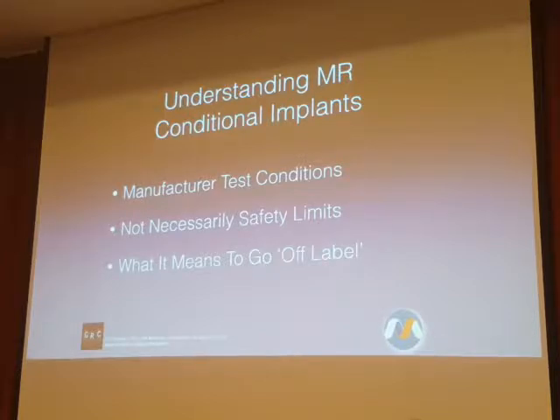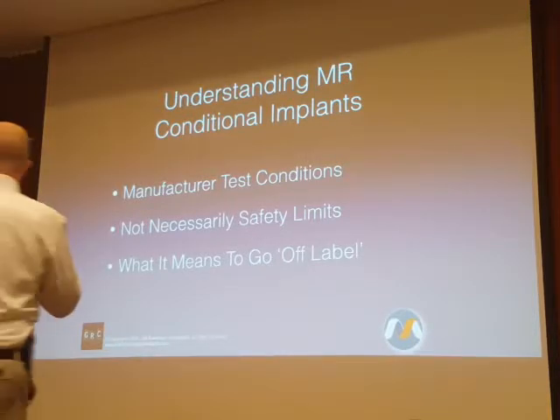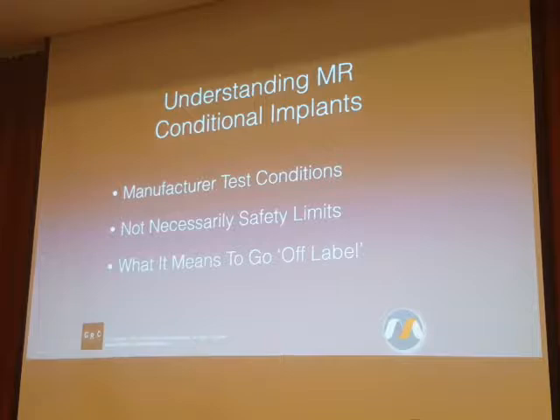I'll give you an example of this. I was working with an implant and device manufacturer. Years ago, they had tested their implant for spatial gradient.